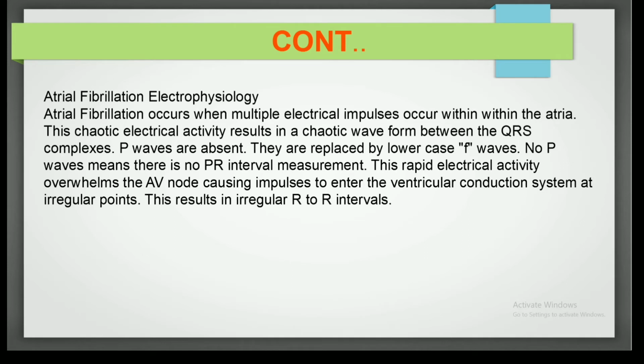Then the electrophysiology. Apart from the SA node, another ectopic foci of electrical impulses originates these impulses, but not from the SA node. Then atrial fibrillation occurs, but the QRS complex is normal.